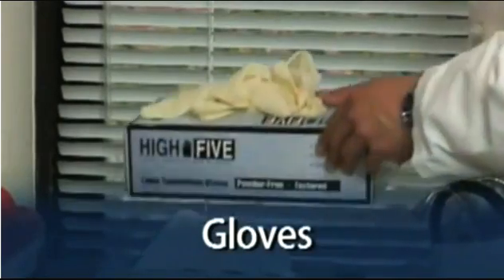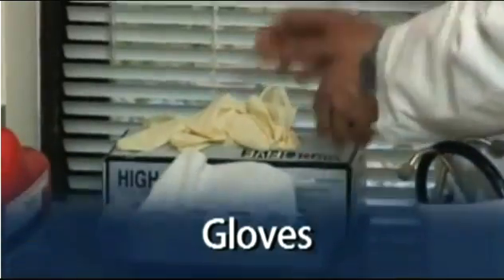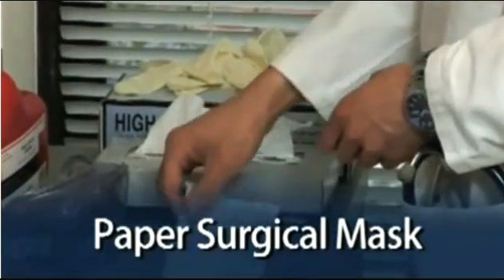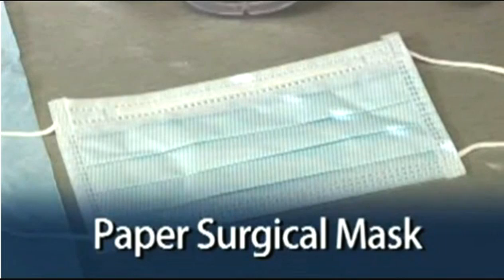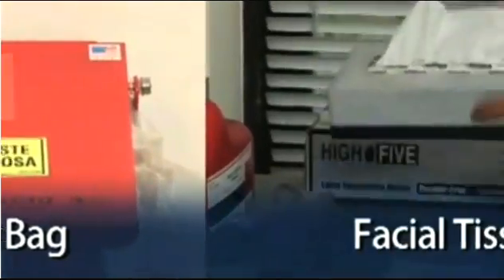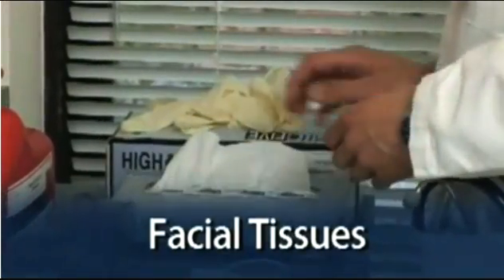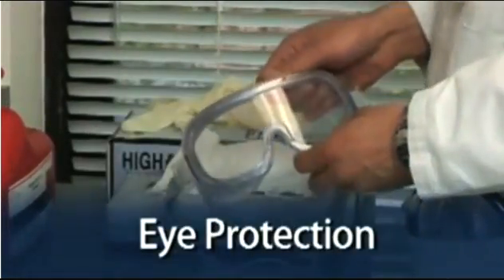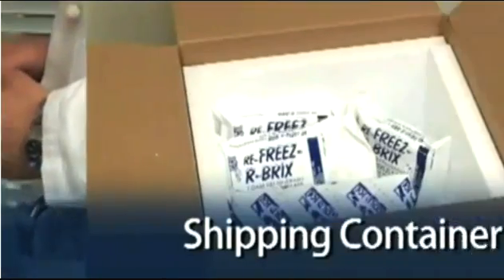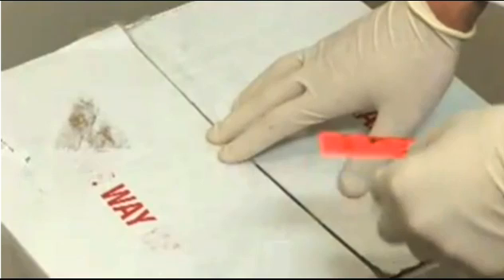Before performing the procedure, make sure you have the following materials on hand: gloves, a paper surgical mask for covering your nose and mouth — there is no need for an N95 mask — a biohazard bag for disposal of used tubing, facial tissues for patient use, eye protection to protect you from coughs, sneezes, or splashes, and a shipping container with cold packs and a biohazard label.